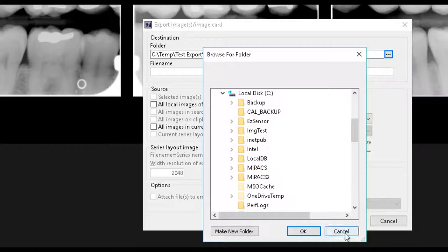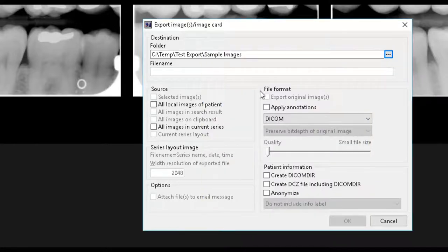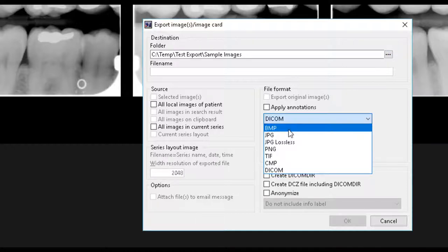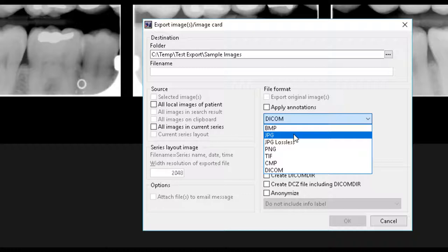Next, select the file format for the exported images to be saved as. After you have selected the file format, it is time to decide what images you would like to export under the Source option.